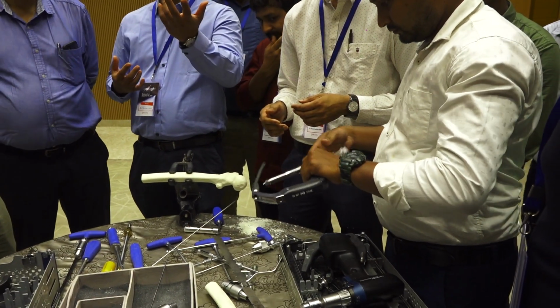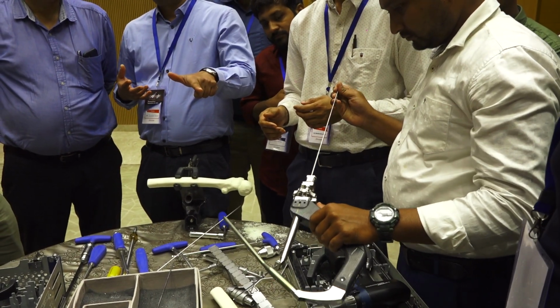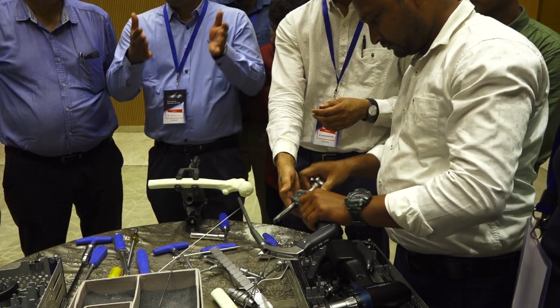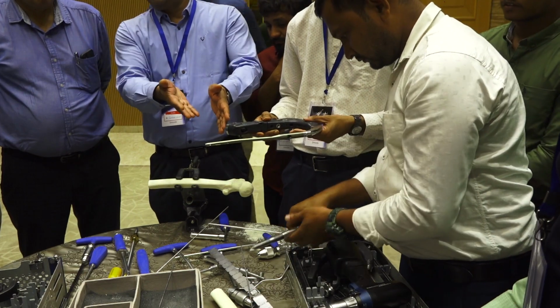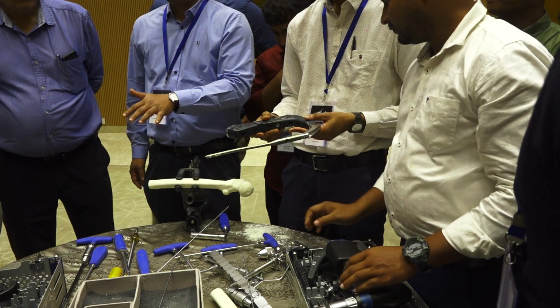Suppose in a valgus neck of 140 degree, you are putting a 130 degree nail. How can it be center? It cannot. So if it is center in the neck, that means it's going inferior in the head, or the vice versa in a varus. So it can never be center.